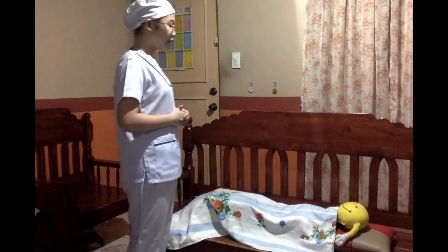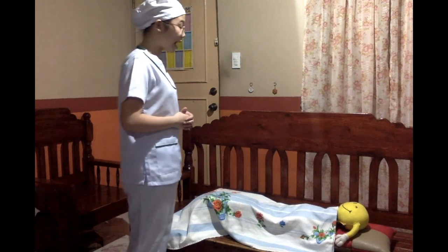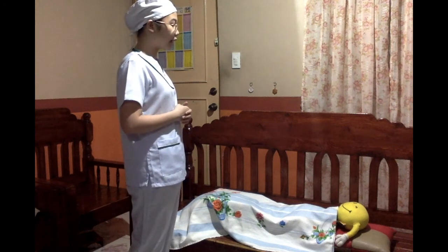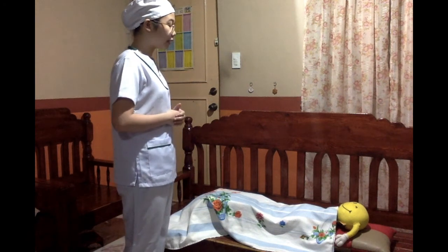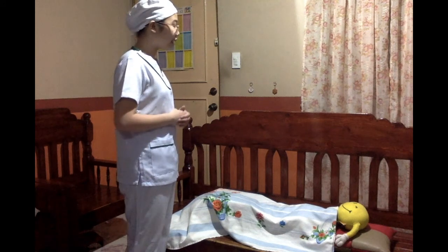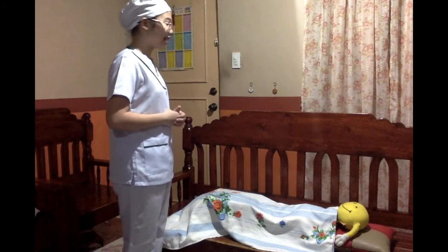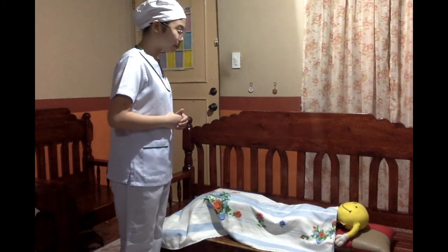Miss Smiley, tanong ko lang din po kung may allergy po kayo sa iodine. Ito po palang sinasabi kong ito po yung kadalasan po na nakikita or ginagamit po natin na palinis ng sugat. O kung matatandaan nyo rin po or kung familiar kayo, mas kilala po siya sa pangalan o tawag na betadine. Wala naman po. Okay po. As I said earlier, we need to determine if our patient is allergic to any iodine-based antiseptics. And if yes, we need to use an alternative for this to avoid any unwanted allergic reactions.